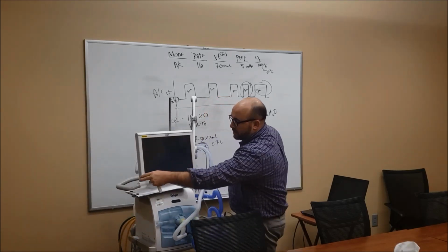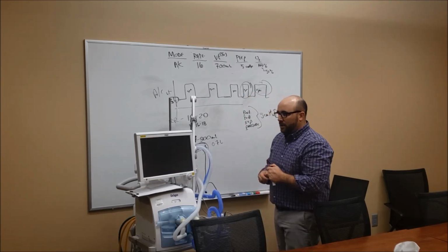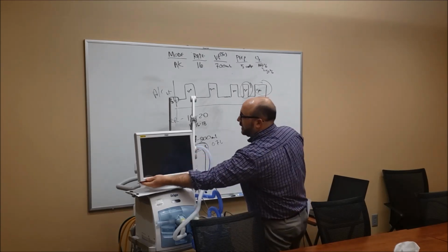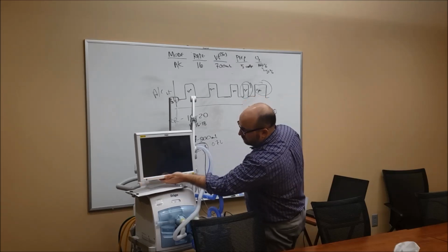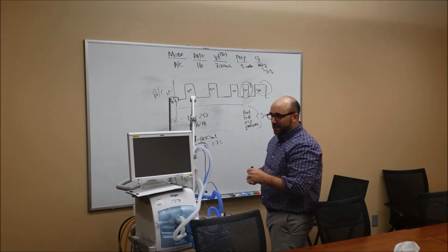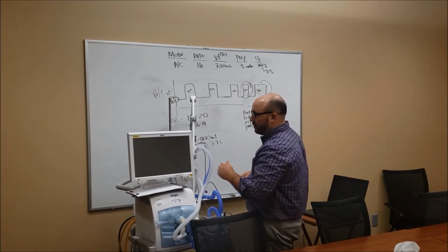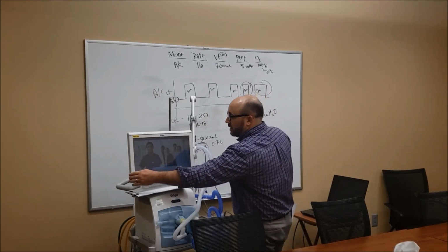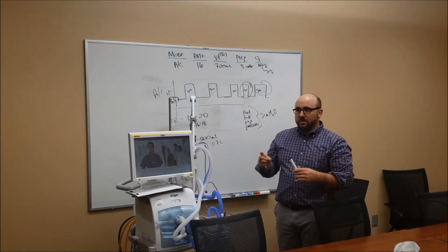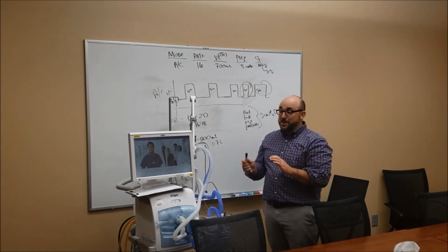The machine comes on, and I'm going to turn it on here now, and you're going to see this screen. It's not going to like it because it's not plugged into oxygen, but it's okay. So this is the screen, and it also is the computer. So it's all kind of involved in that. All this area down here is where all the ventilation comes from. There we go, you can see the screen coming on now. See how it's in color? That means it's coming on. You see how annoying that got, how it took a while? I don't like that at all. And they knew that happens.